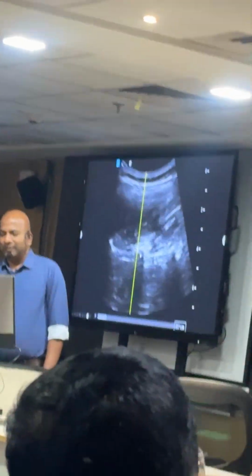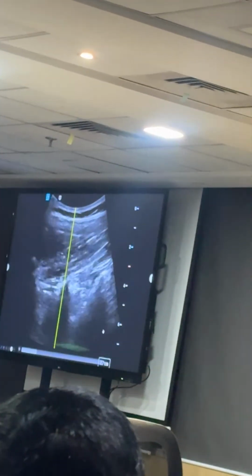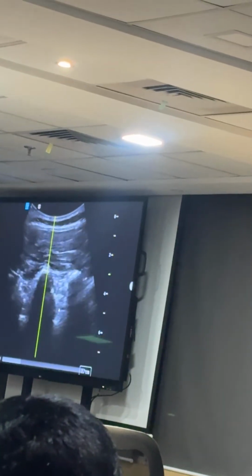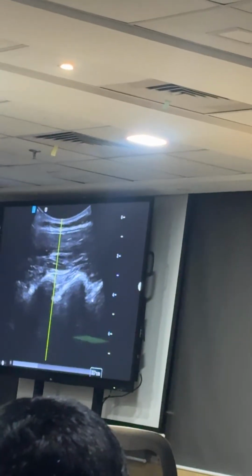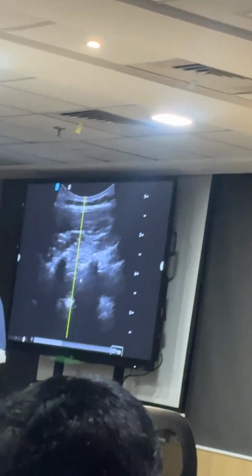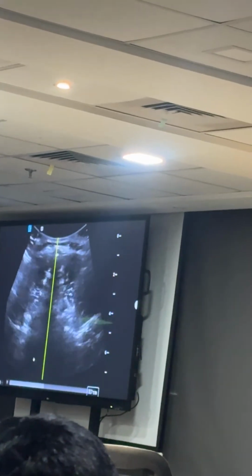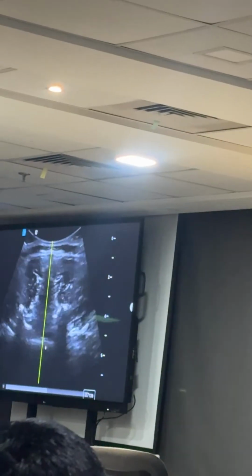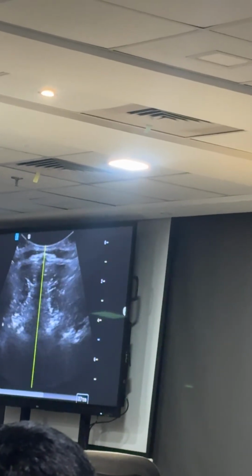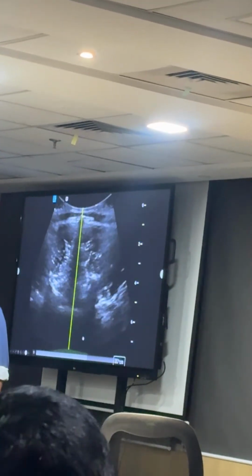So you can see, these are all the, what is this sign? Paramedian sagittal. These are all the three finger-like projections. So this is the trident sign. As you arrive at the articular process, these lines will become a continuous line. This is a camel hump. From there, if you make an oblique tilt, you can see a horse head. This is a transverse view where you are seeing the tower. And from there, if you slide in between the two spinous processes, you can see the articular process on either side and the transverse process. This is a cat head appearance.